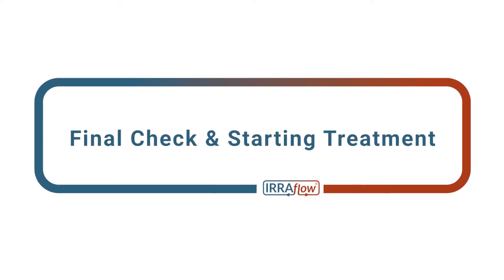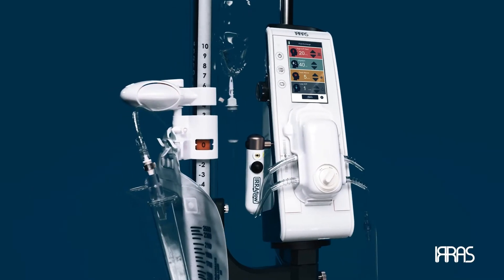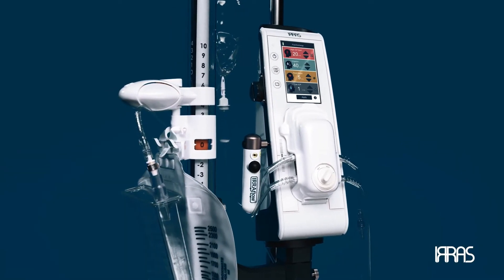Chapter five: final check and starting treatment. We have now completed all the necessary steps to set up the airflow control unit. You are almost ready to start treatment.